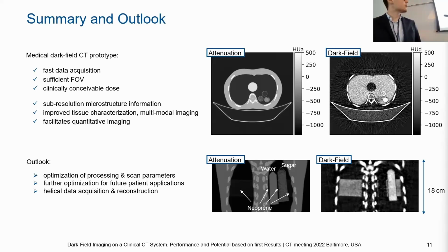And here on the right side, you can see the first two images that were acquired with helical acquisition. Again, here we measured our lung band phantom. And yeah, so that's just a small teaser of what's hopefully coming up next.